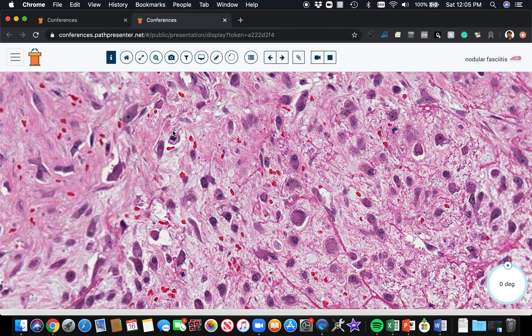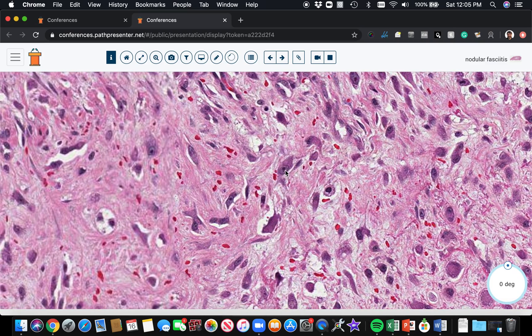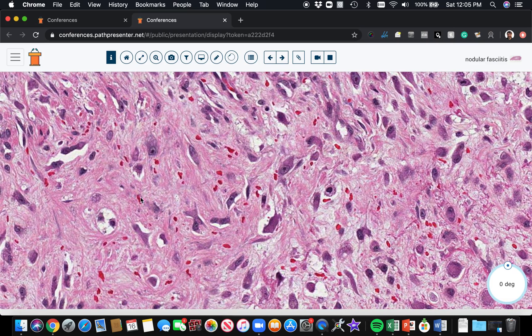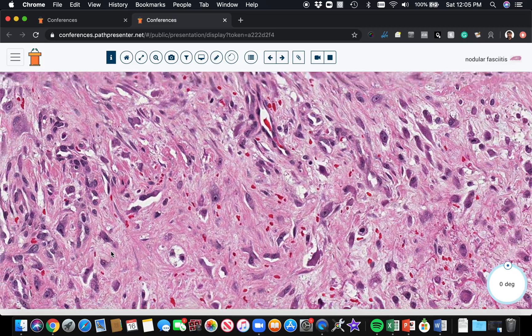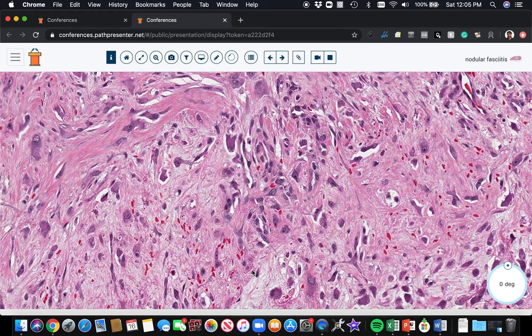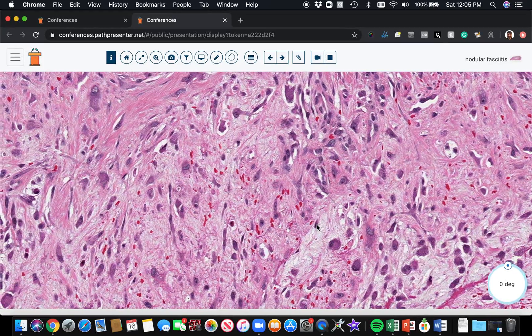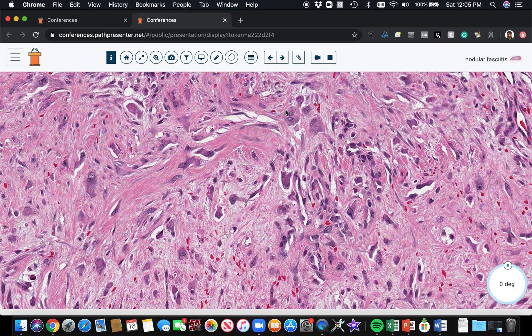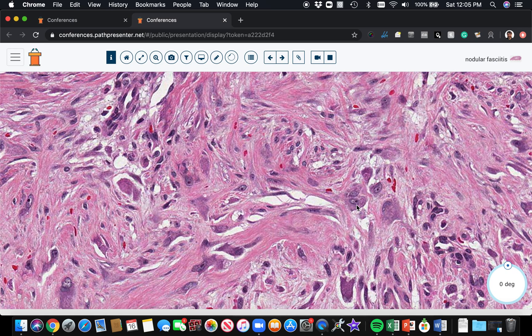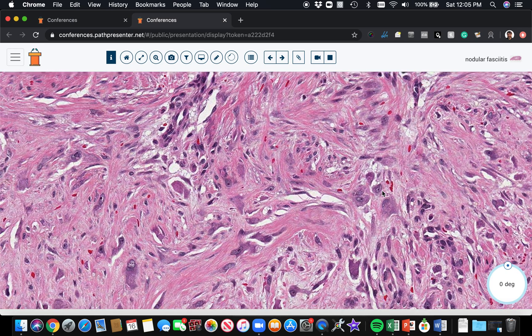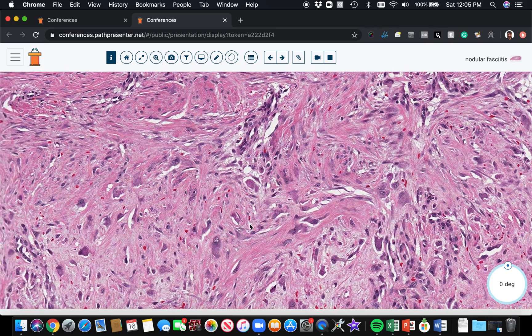Look at these big, plump, round cells that have large, round nuclei and prominent nucleoli. They look like little eyeballs staring back at us — kind of scary looking. These have been called ganglion-like cells. They look kind of like the ganglion cells you see in a nerve ganglion. But in this case, they're actually a variation of fibroblast or myofibroblast, and they're just scattered around here in a lesion that otherwise looks like nodular fasciitis.